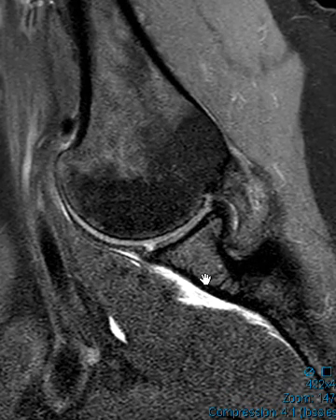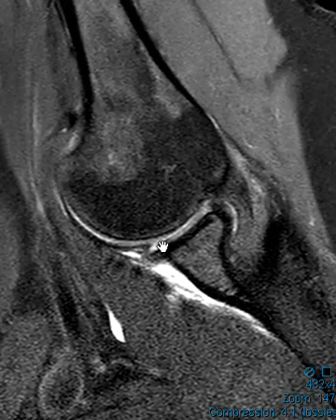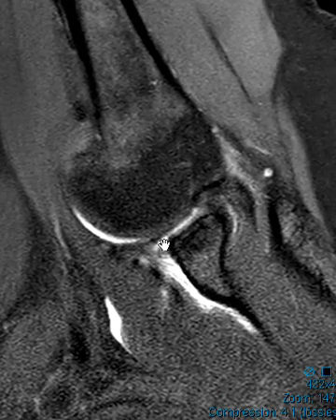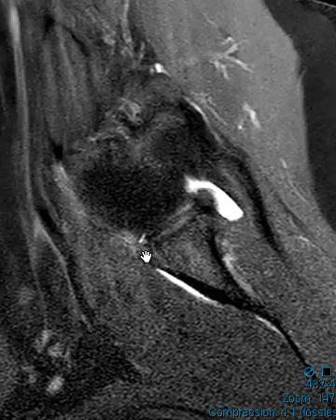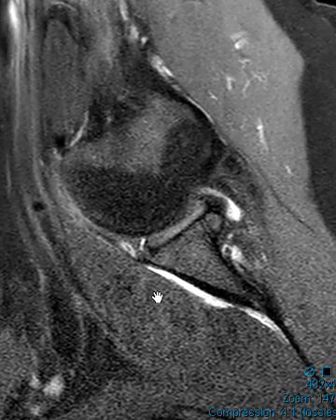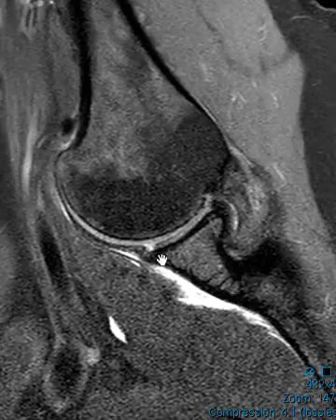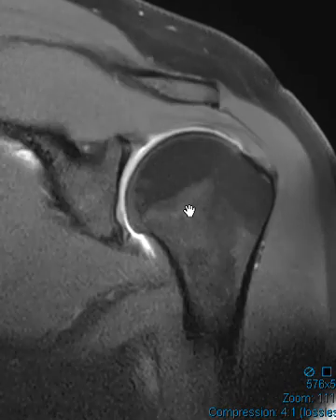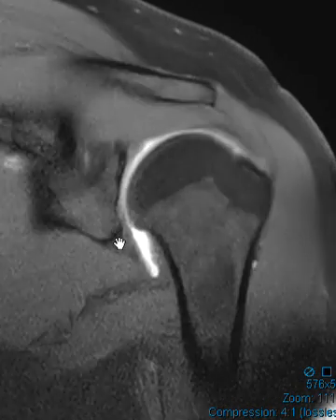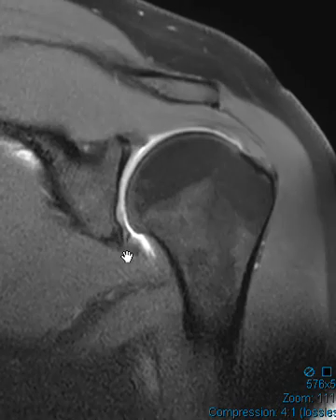The labral tear will be better seen. This is a great example — with the arm in the neutral position you really couldn't see this very well. But now you can see a fluid-filled gap right here, going through the anterior labrum and all the way through the inferior labrum. You can see the fluid, and it looks like it's detached and pulled away slightly on some of these images. So it's a significant tear really easily seen on the ABER images, whereas you really don't see it well on the non-ABER images — it sits right back in place with no contrast visible. This shows how really important ABER images are. So that's it — thank you very much.